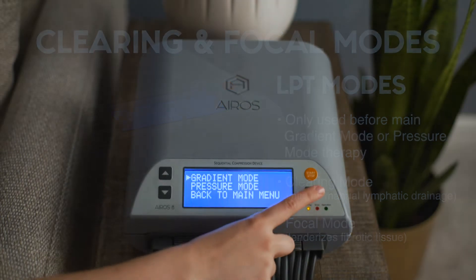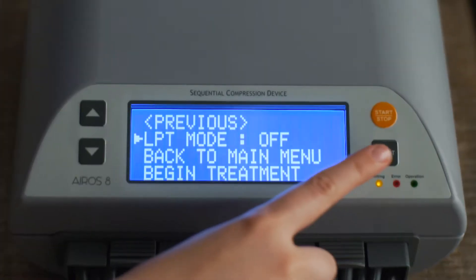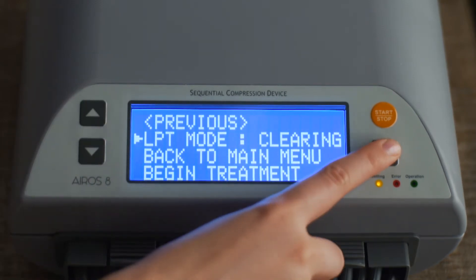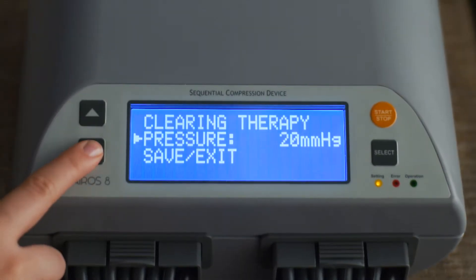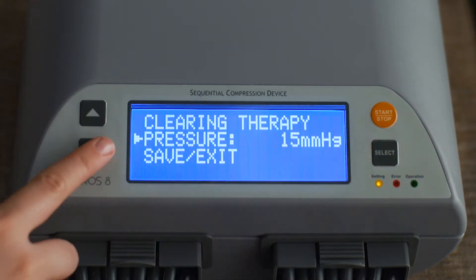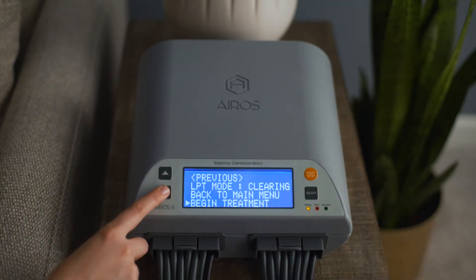To operate the device with clearing mode, from the gradient mode setup screen, scroll down to LPT mode and press the select button. The mode will start blinking. Scroll to clearing and press the select button. To set the pressure, scroll to pressure and press the select button. Pressure can be set at 15 or 20 millimeters of mercury. Press the select button to confirm your selection.